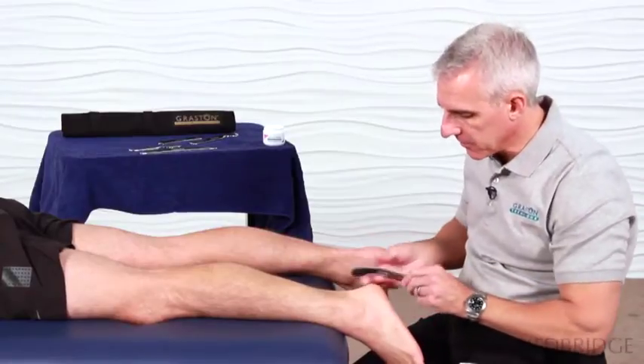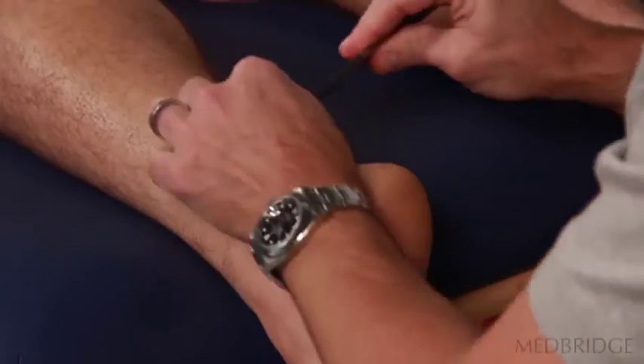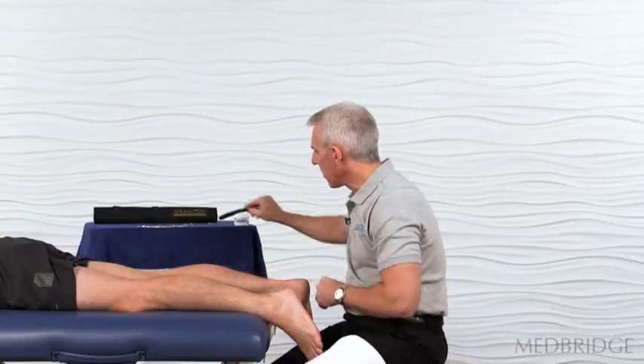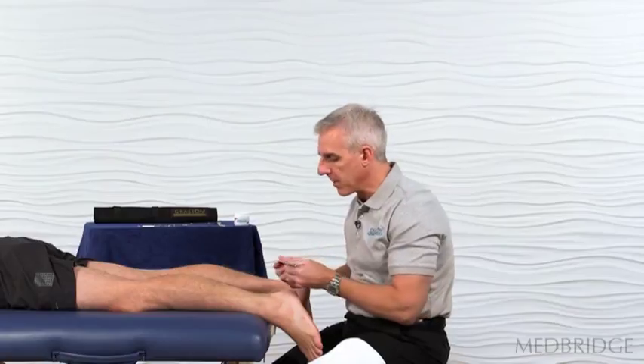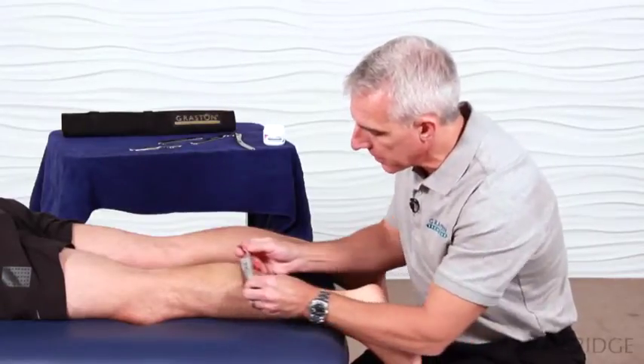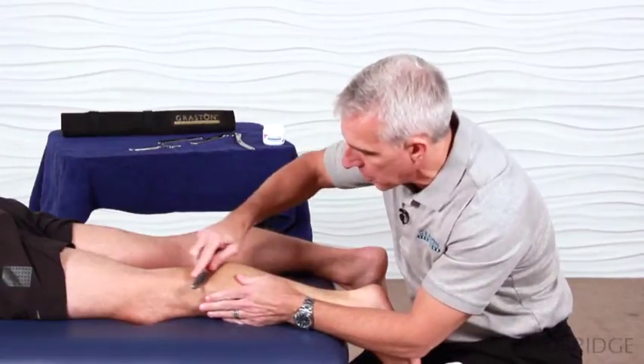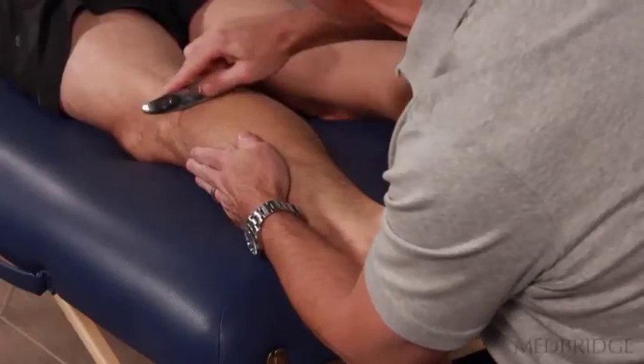The GT5 works very nicely on large convex tissue. If I wanted to get a little bit more specific, I could go to GT4 with a convex treatment edge. Now my treatment intervention is going to be a little bit more focal, so the same amount of pressure will be more aggressive to a smaller area.